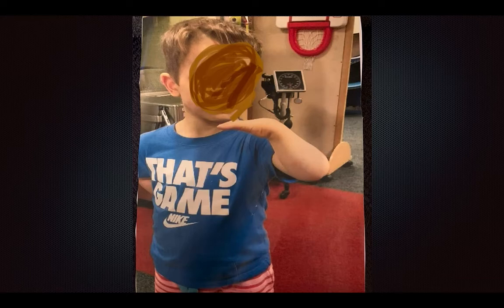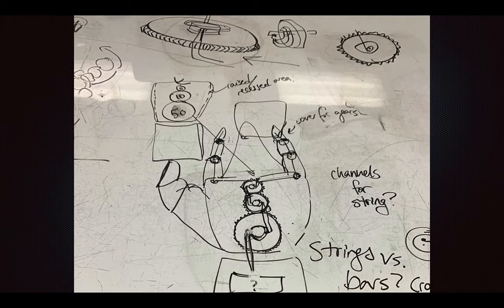So they collaborated together to come up with this, where they actually surrounded his finger with 2 mechanical fingers. The wrist was going to be strapped, the machine was going to be strapped to the wrist at the bottom of the picture. They were going to use gearing to create the motion in those fingers to close it. They were later on going to connect off the same gearing system, something to the thumb to pull that closed also. And if you look just above the picture to the left, you see that 50, 10, 5 in those circles. Well, that brought up the whole idea of gearing ratios, so they had to teach that to themselves.